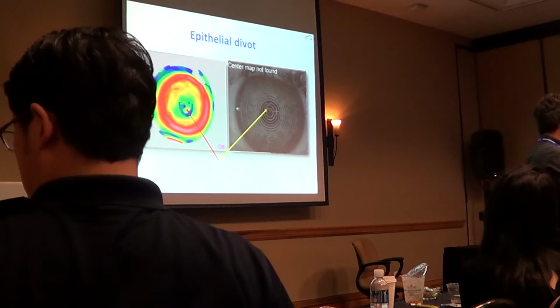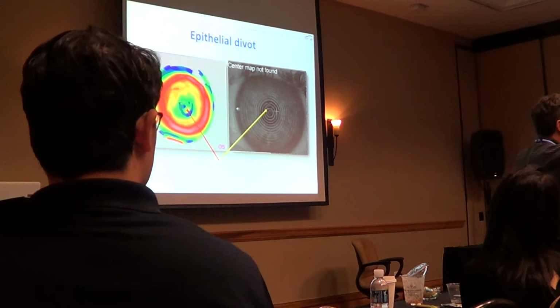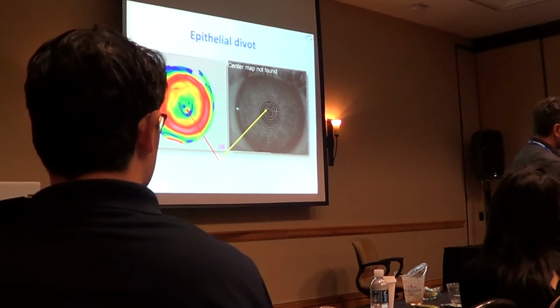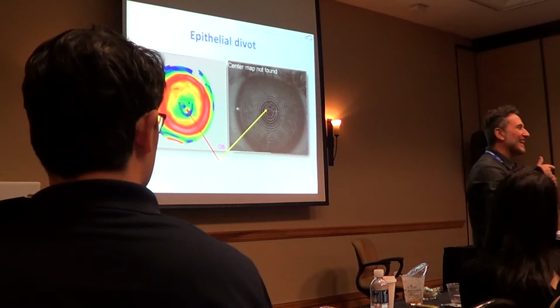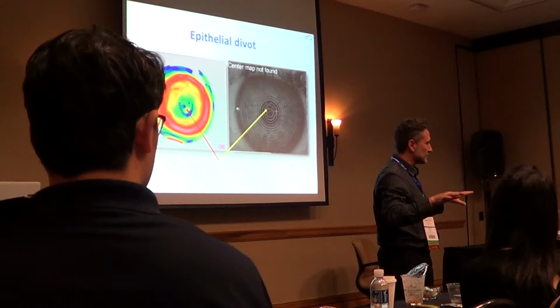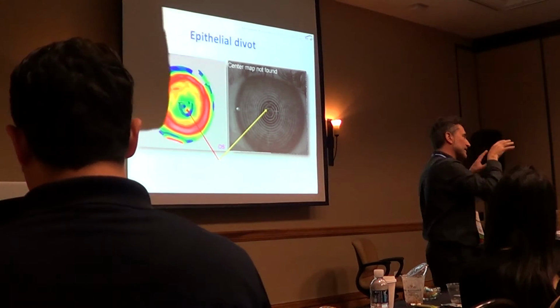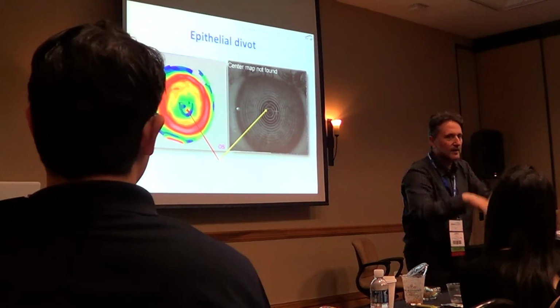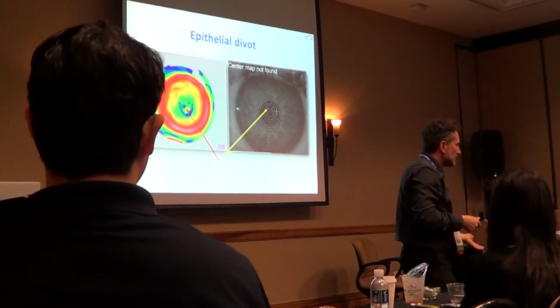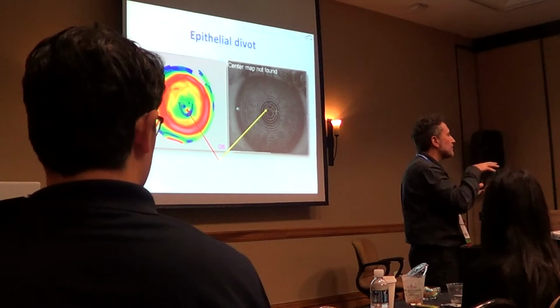We are all trying things. So in the past I worked by trial sets. Then I moved to empirical, and then I moved to trial set plus empirical. So at this moment I am again in the trial set plus empirical. So I calculate the lens using the topography data and so on. I choose from my trial set the closest lens. I place it on the eye with the fluorescein in, always from down to up, okay, to avoid bubbles.